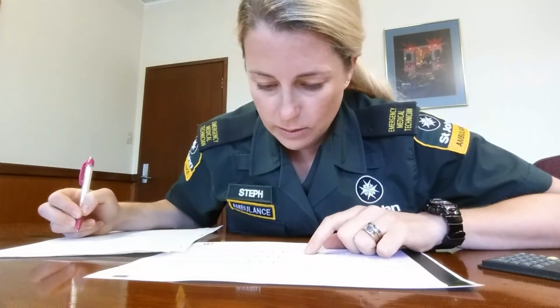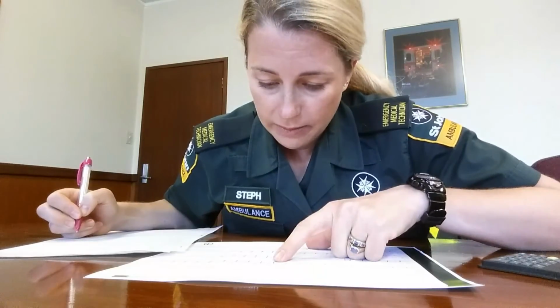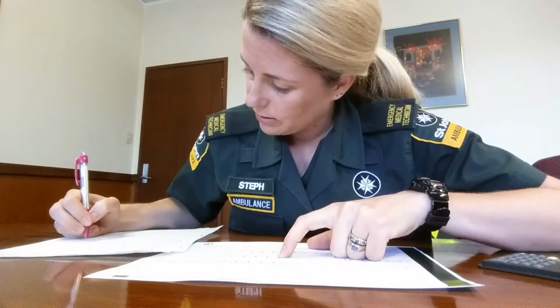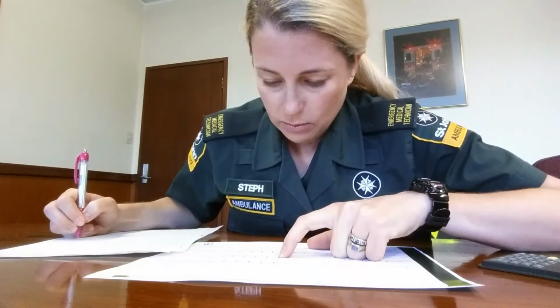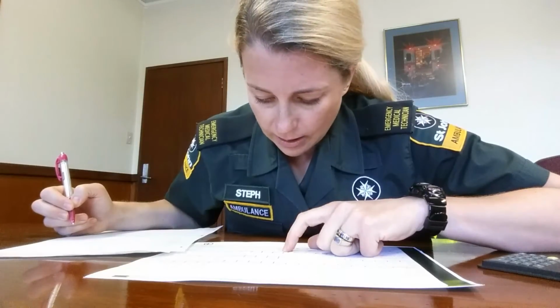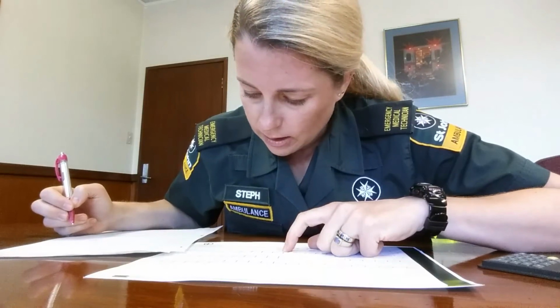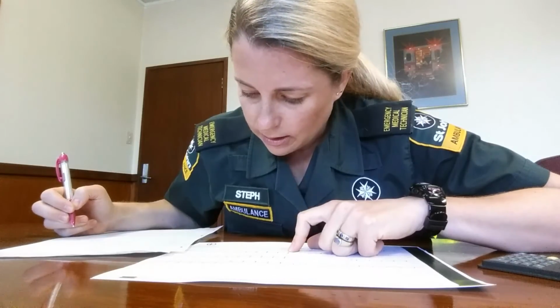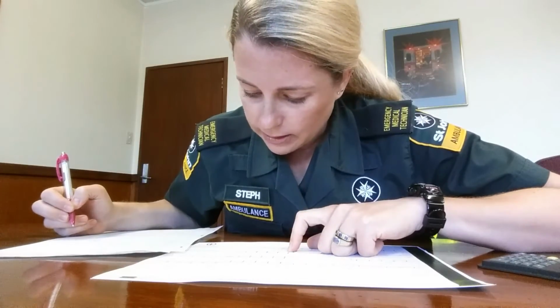Looking in other leads as well. So we have quite significant depression in V1 and V2, so I'd want a posterior ECG as well to look at reciprocal changes for that. And I do have elevation in the lateral leads as well.